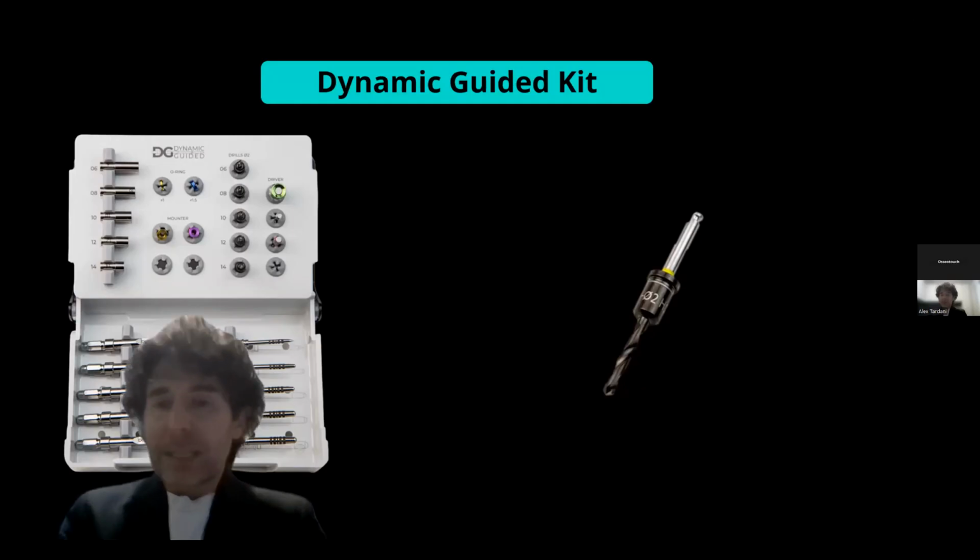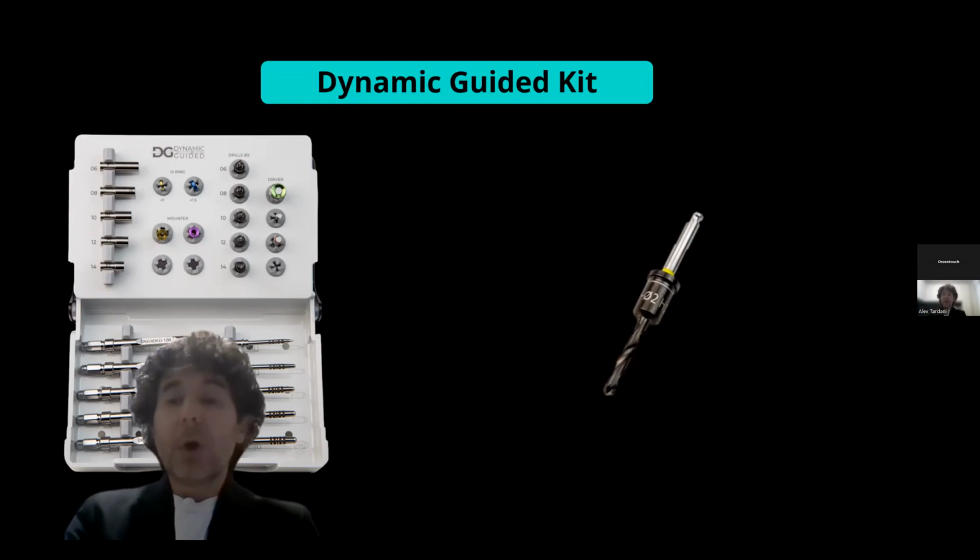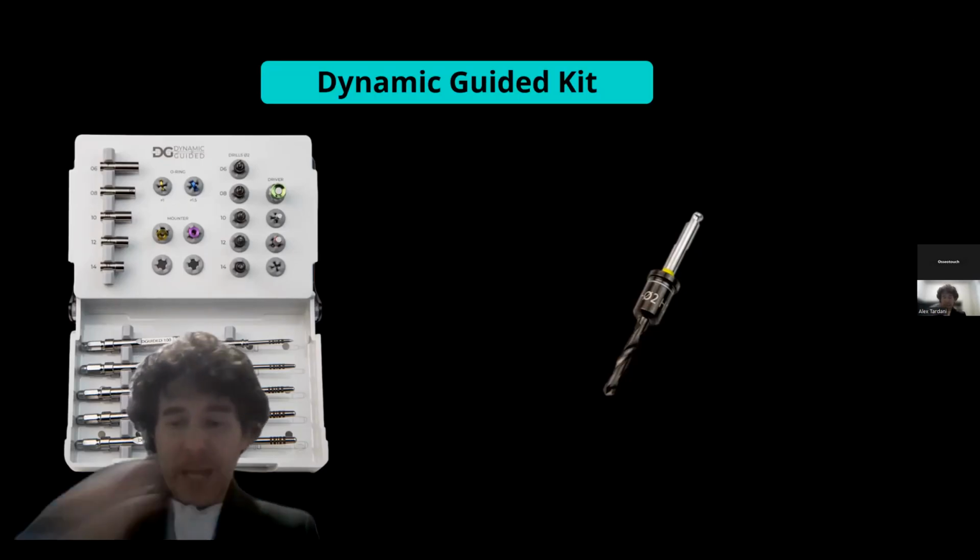One thing I'll give you as a simple tip is that all the drills we use, even starting from a length, let's say 6 for example, drill slightly deeper, so they give us that extra 0.5 or 1, depending on the drill, of extra depth, which in some cases can ensure a greater and better expansion, so an expansion with less tension, of the bone that we will then go on to modify using our magnetic mallet.